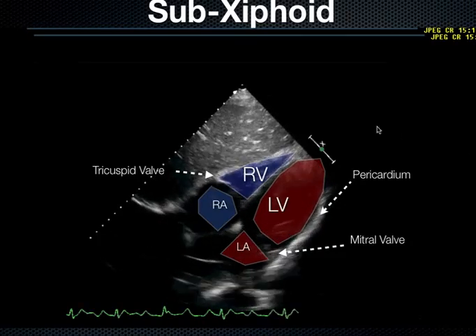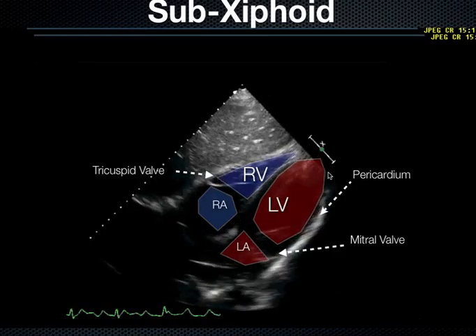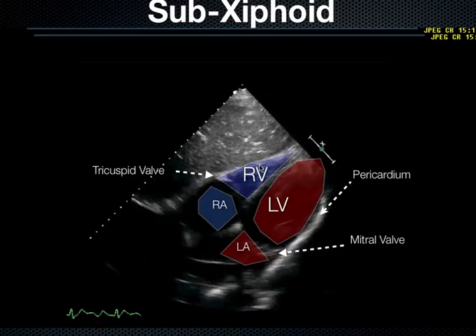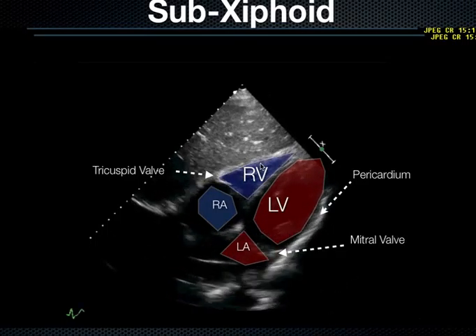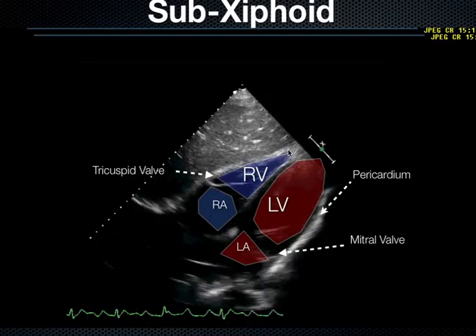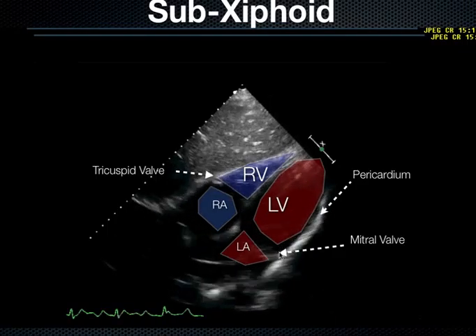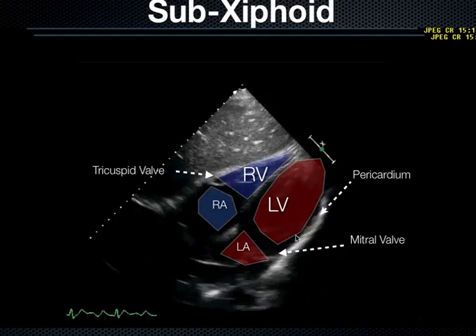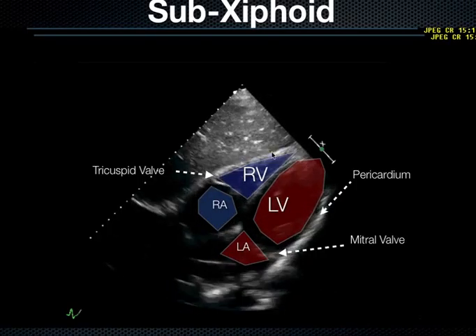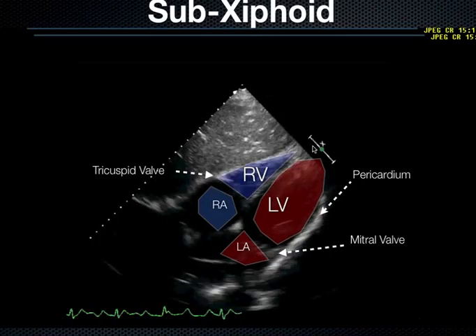The second thing I use this for is pericardial effusions. This is the best view, the most sensitive view, to check for somebody having a pericardial effusion, or fluid between the myocardium and the pericardium. This is a very sensitive window for that. You see, in a supine patient or somebody lying flat, the heart is heavy, and it sits in its posterior pericardium, squishing any fluid anteriorly. And so this is exactly where you see these pericardial effusions, right along this anterior area.